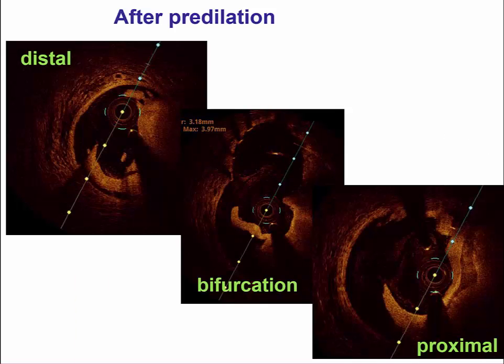These still frames demonstrate distal dissection, the good expansion of the ostium of the side branch, and some persistent dissection proximal to the origin of the diagonal.